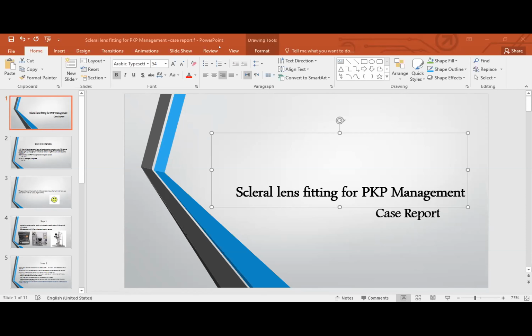We wish to answer: as long as there is no corneal opacity and you have a clear cornea, you can go ahead. Yeah, Dr. Damati, absolutely.